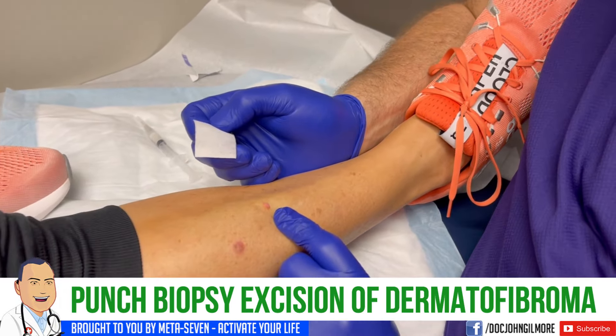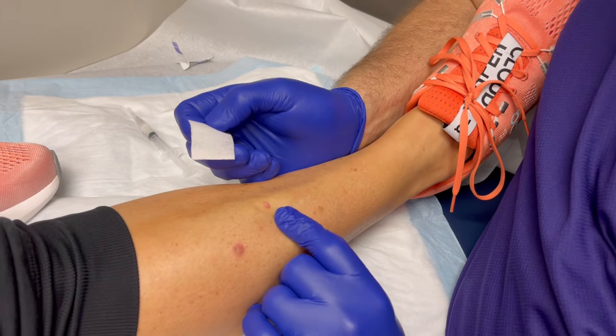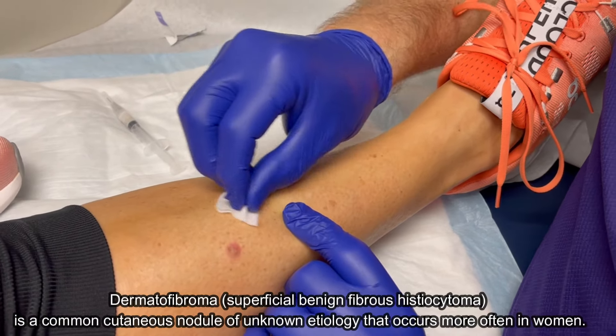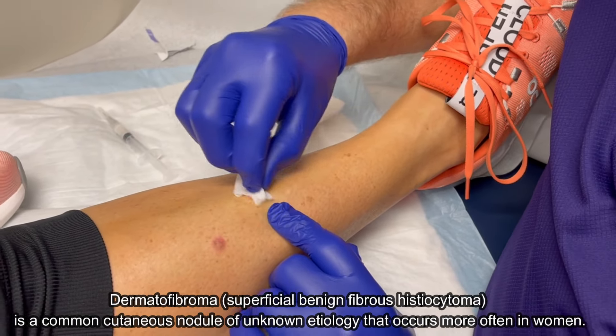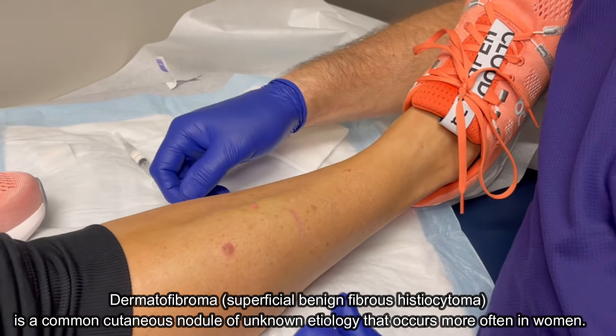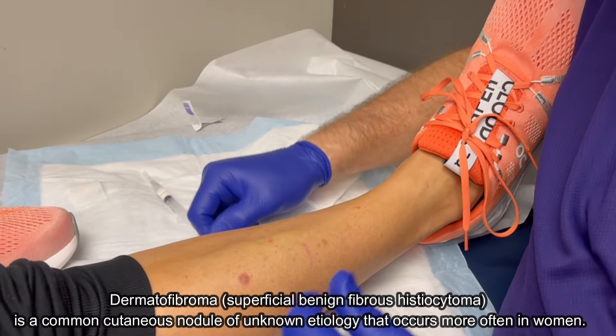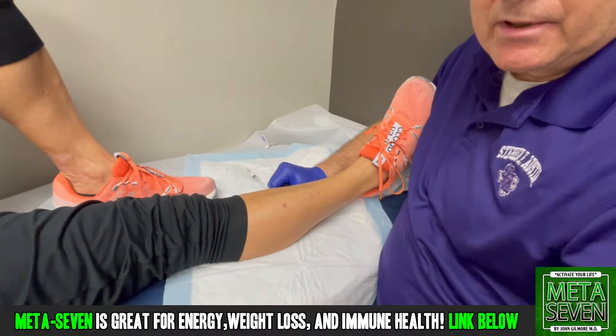Gigi has what looks like a dermatofibroma and we're gonna remove it — we're gonna do a punch biopsy excision. A little bit about punch biopsy, because you might think — well, I'll explain as we do it.